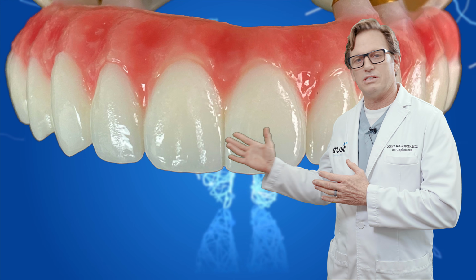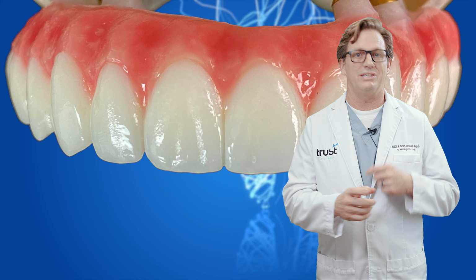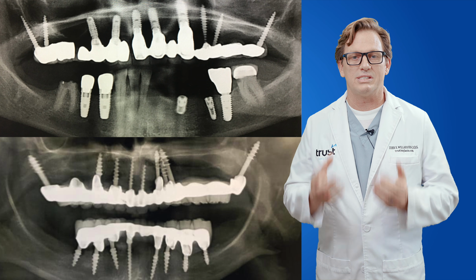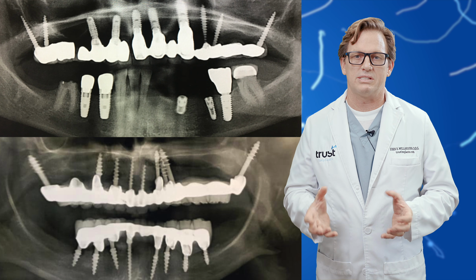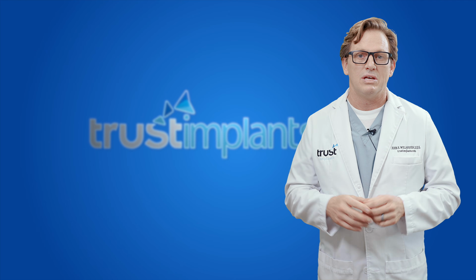You know, like these images here showing patients who have already gone through the process and now having to go through it again. Take a look at these images and you can see how there was no rhyme or reason, no planning. The doctors were just putting in implants all over the place, and now the patient suffers because they have to go through it again.